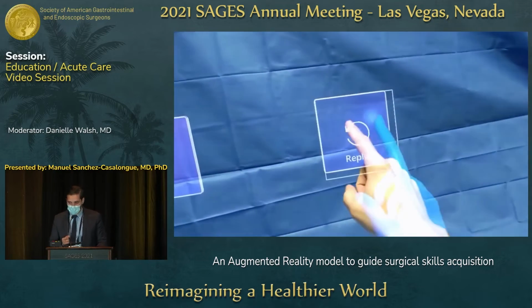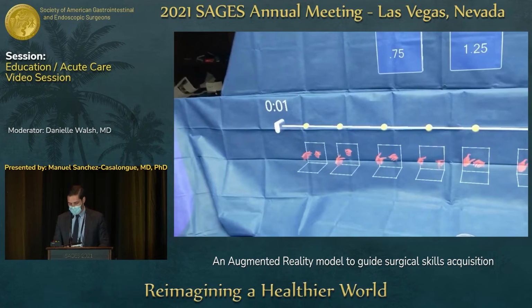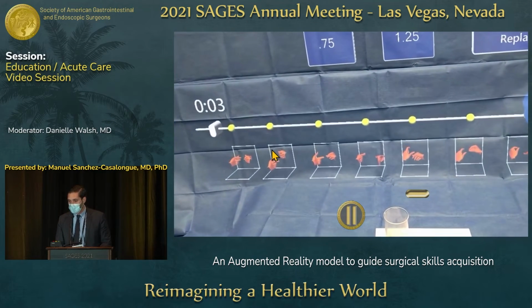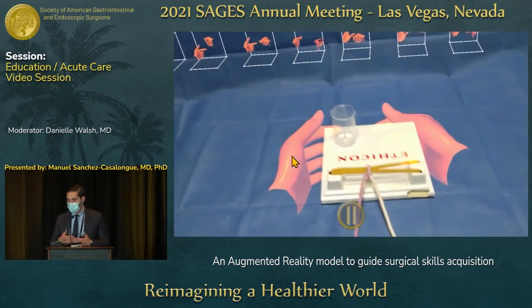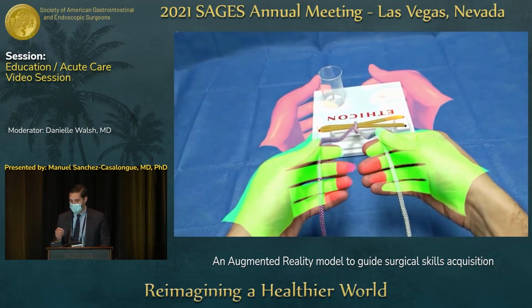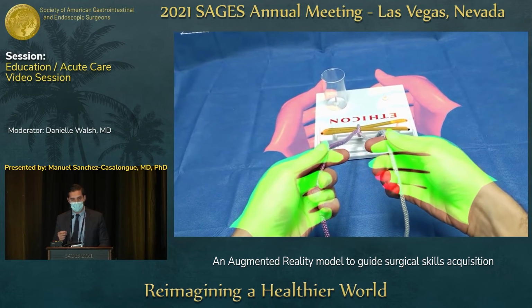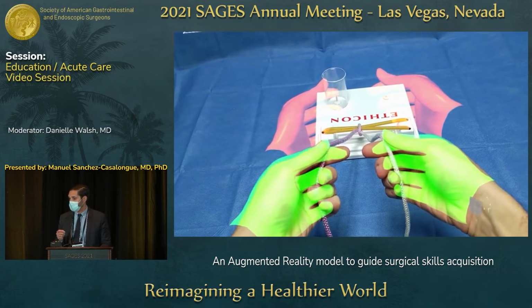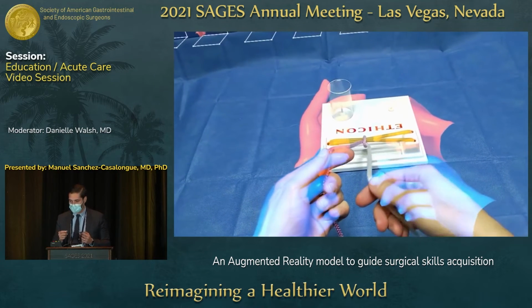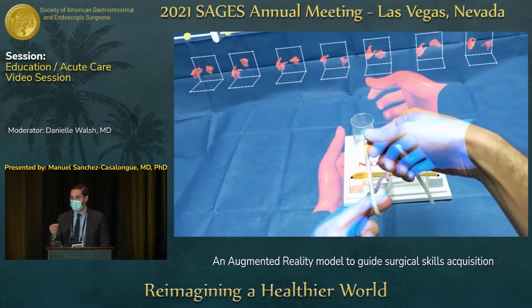The student, again, here is selecting this. They hit replay, and you see a similar user interface, now with some added markers, so every yellow here is a marker of that position that was pre-recorded, right underneath the hand position. And this is the third feature of our system, the feedback. So we see in green fingers that are in the right position. We see in red fingers that are not yet in the right position. The student has time to adjust the position of fingers and joints, and based on that, they can achieve the correct pose, and they can move on to the next marker.